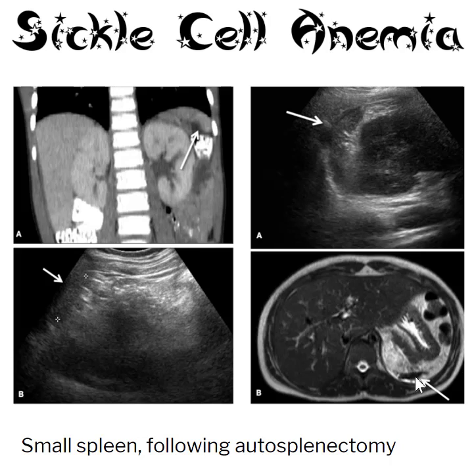Down in this example here, we have a transverse slice. It looks like maybe an MRI on this one. This is the spleen right here. Typically that spleen does take up a good portion of that left upper quadrant. It has now been degraded down to just this little piece. And again, we can see just a little sliver of it in the corner here. So these spleens are very, very difficult to find. I would suggest trying to look back at any previous imaging that you can find and just do your best. It is not uncommon for them to be gone completely.